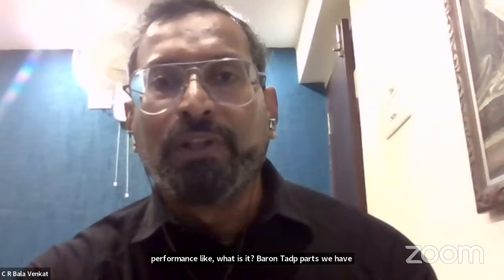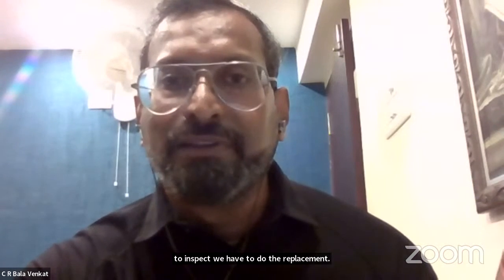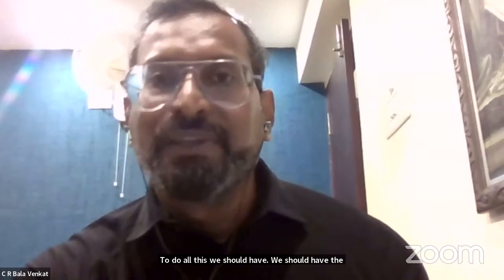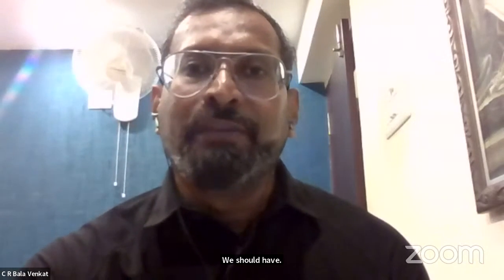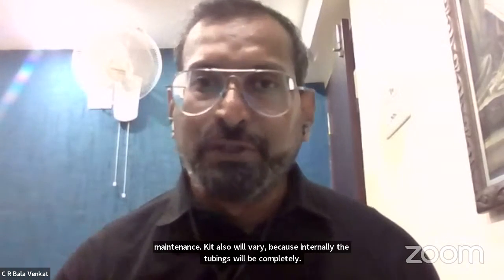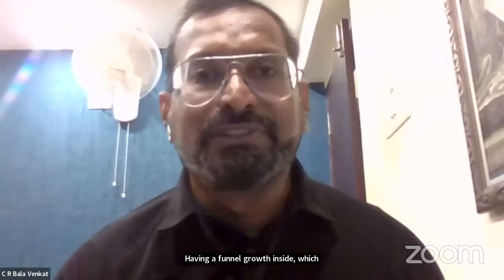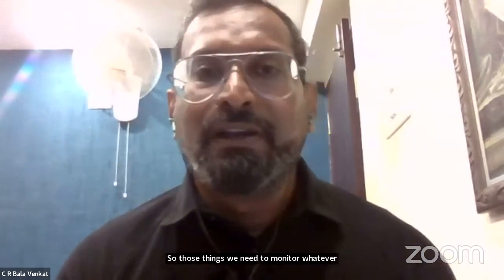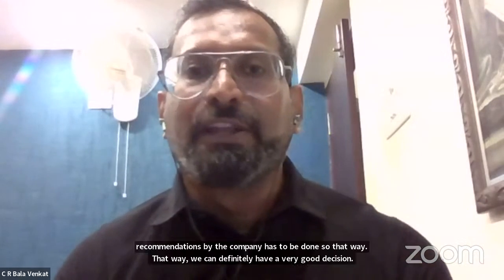So to do all this, we should have the instrument in contract. We should have a PM kit, based on the age. The maintenance kit also will vary, because internally the tubings will have fungal growth inside, which requires a replacement. So those things we need to monitor. Whatever recommendations by the company have to be done. So thereby we can definitely have very good precision. That will be reflected in your calibration.